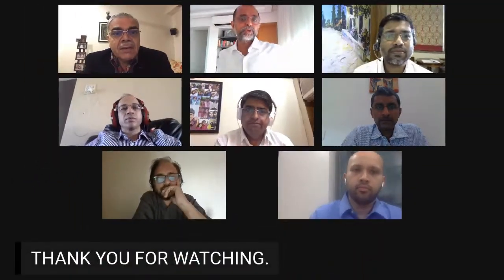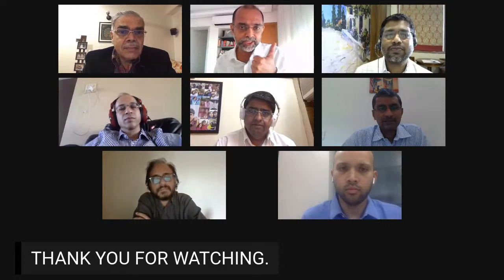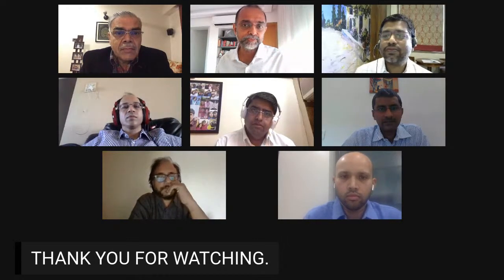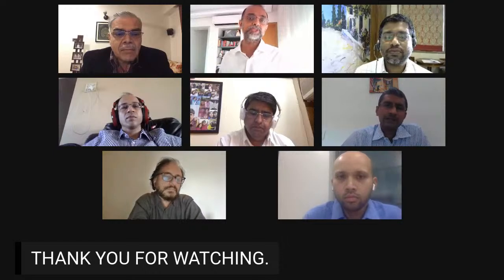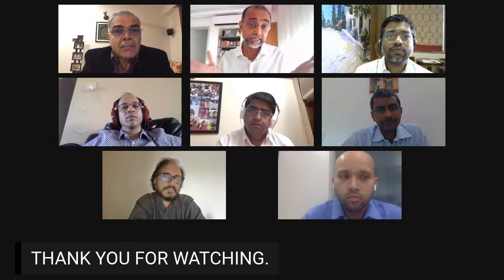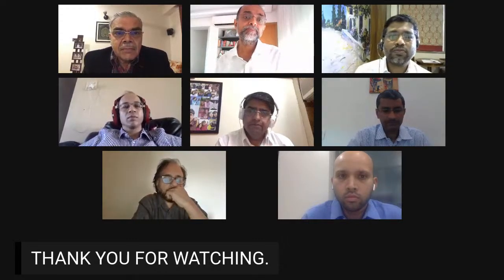Yeah, thank you very much, Shantanu, and thank you everyone. Very good variety of complexity. I think the basic takeaways are good guide support, and choosing your catheters and armamentarium properly and adequately. Don't be shy of debulking when you have to get a good result. Use imaging whenever it is possible, given financial constraints. And of course, make sure that you give the patient the best benefit in terms of the residual SYNTAX score, especially in multivessel disease. What Amit did in terms of revascularization of all the three vessels was an excellent example of that.